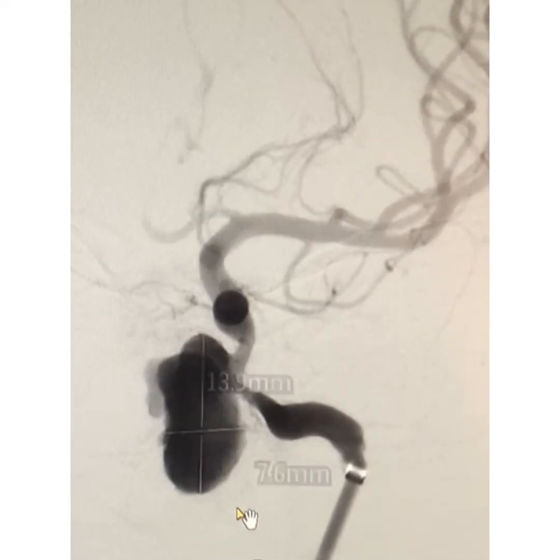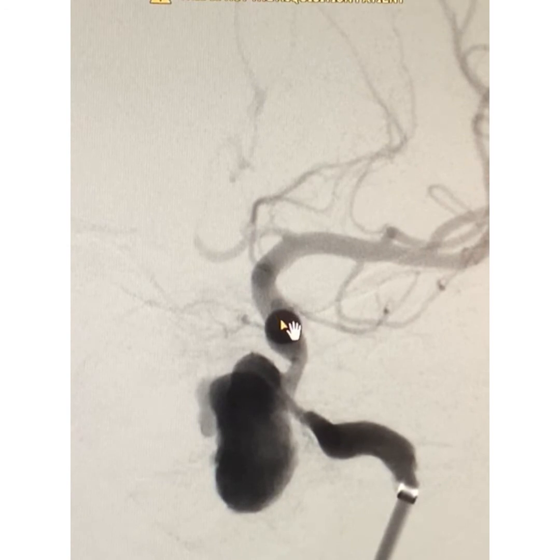So just look at this anatomy. It's very irregular, and with the flow diverter, we'll just put the flow diverter across the aneurysm, and we will keep a catheter beforehand so that we can just coil and come out after deployment of the flow diverter.